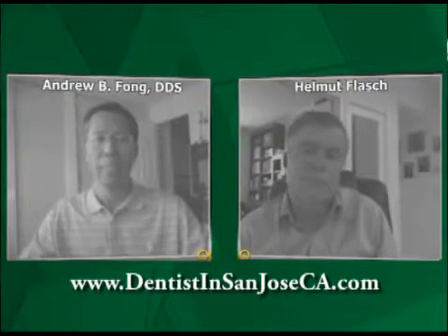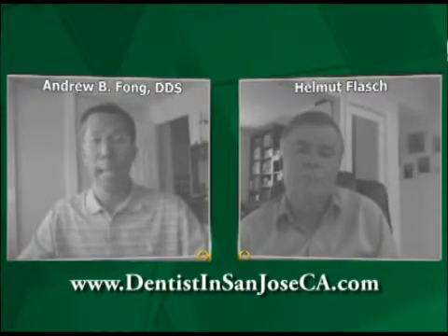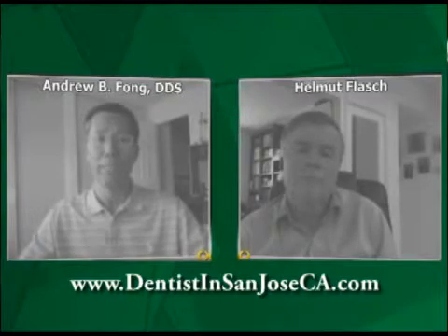Now, with the implant denture, we can create it in such a way where the roof of your mouth is exposed, and so you have a better opportunity to be able to enjoy the taste and texture of the foods, which will make it more natural and more enjoyable when you eat.